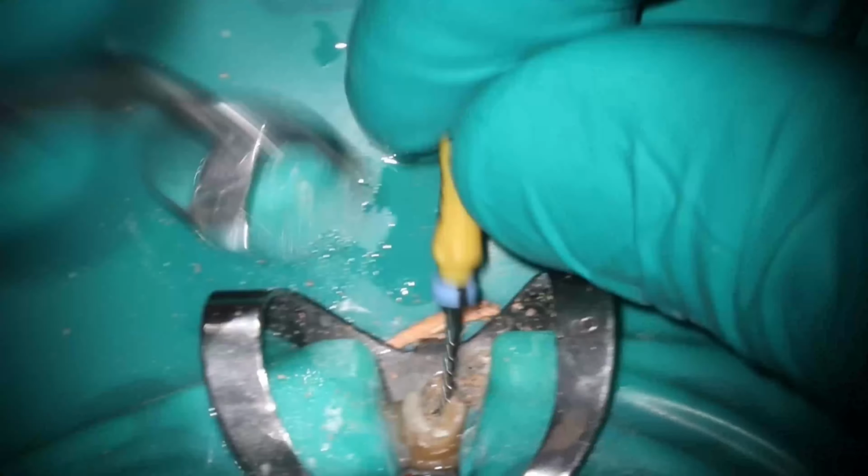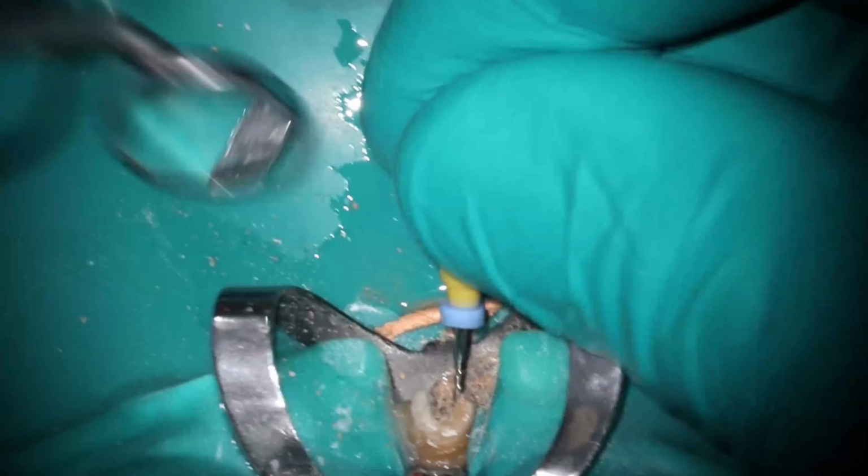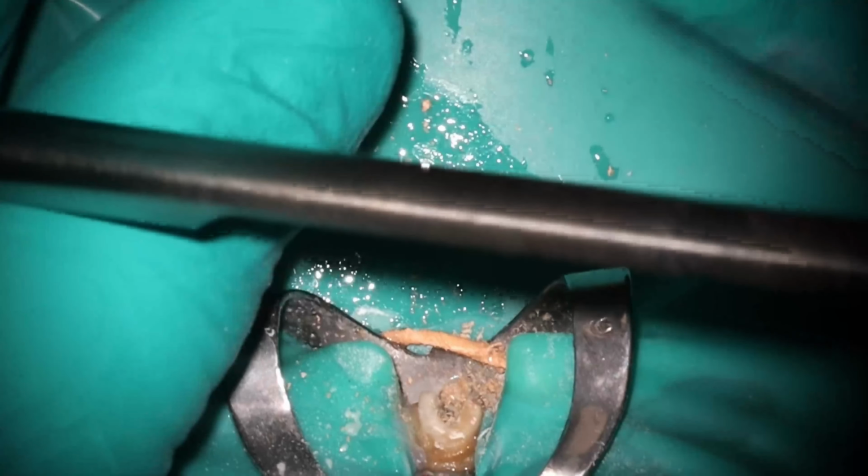There's no issues as far as chloroform and all the crap associated with that. And we can pretty quickly, this is maybe 2 minutes into the procedure, we have removed the vast majority of the gutta percha, and I think with this last little twist right there, off it comes. Some people asked about how I do my hand filing.